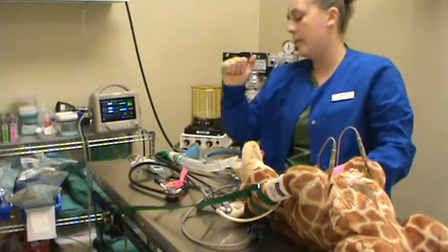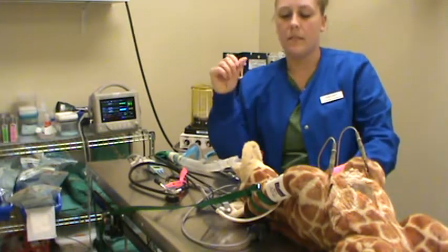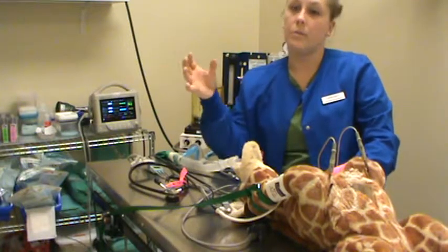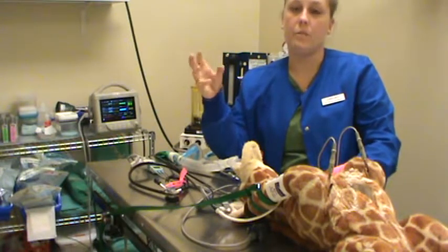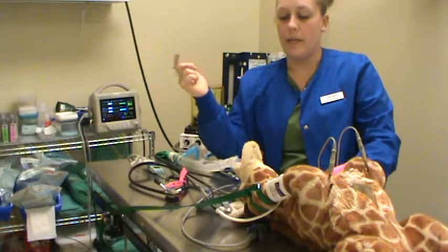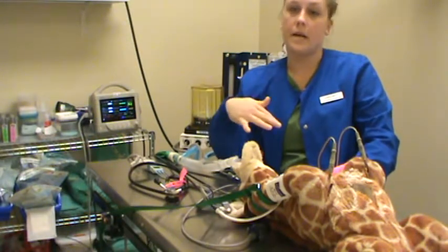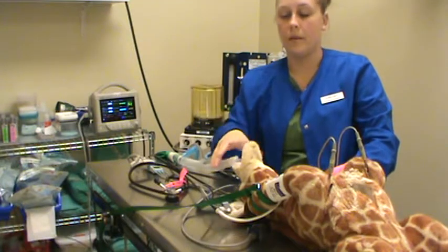Not sure I went over the SpO2 number, so that really needs to be anywhere between 97, 98, 99, 100. Obviously with 100% oxygenation being ideal. 98 and 99, you're okay. If I'm seeing 97, 96, 95, I'm going to be checking my monitors.